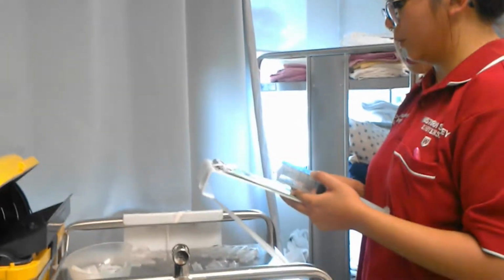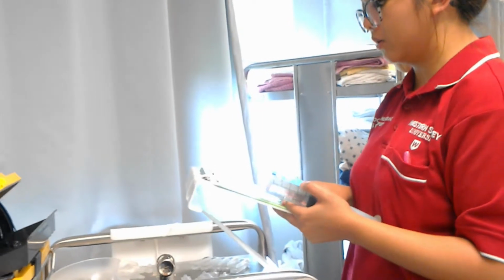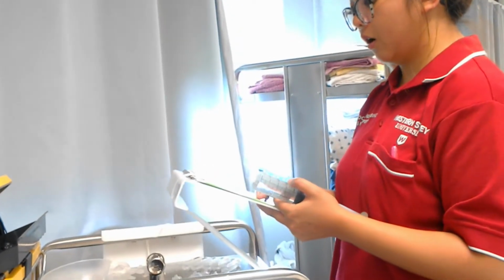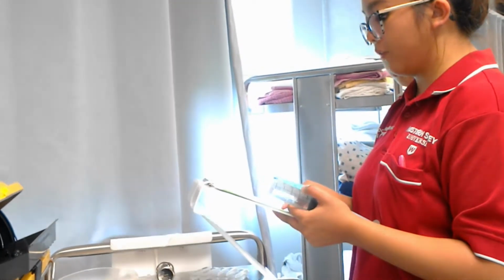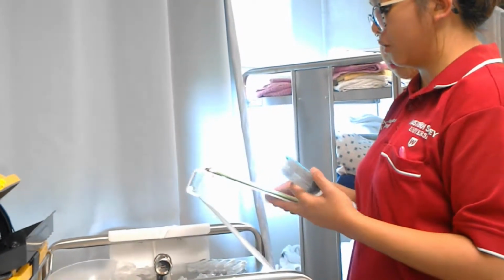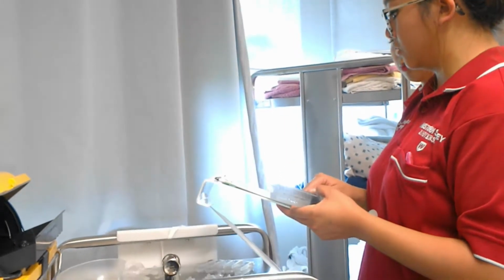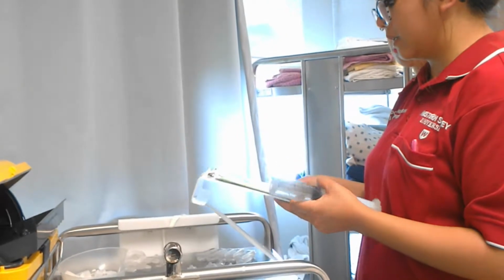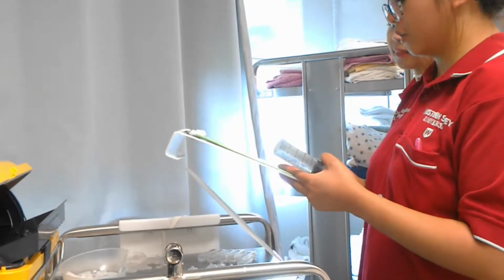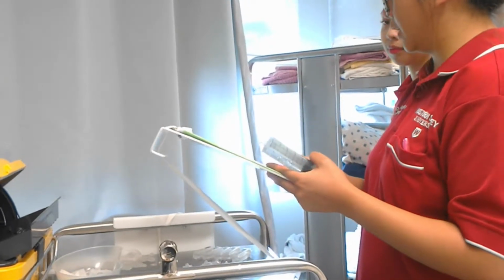And also the PCA criteria, it's been listed the concentration is 1 milligram per 1 mil. There's three number of syringes needed, and the PCA dose is 1 milligram. Lockout interval is 5 minutes. Basal infusion is 0 milligrams in an hour. Hourly dose limit of 12 milligrams has been signed by the doctor. Also, the doctor's name has been printed and it's within 7 days. An antiemetic of metoclopramide and naloxone has been also given. It's due now, hasn't been given yet.